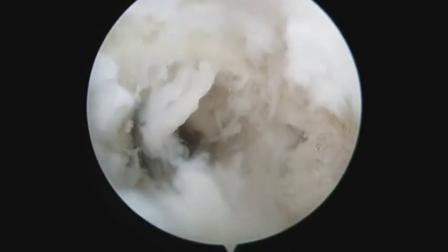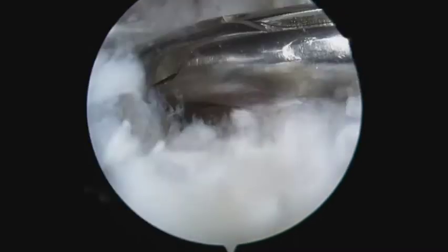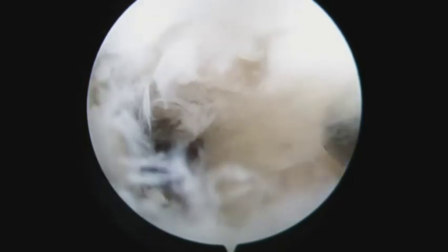Bone grafting of the seat is optional. It can be performed by microfracture of the seat wall with an arthroscopic awl, and filling up the cavity with cancellous bone graft through a drill sleeve.